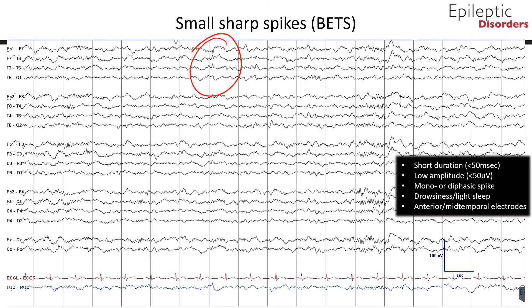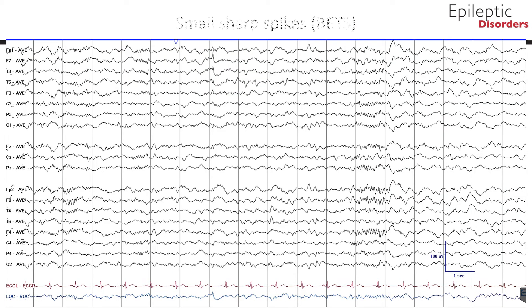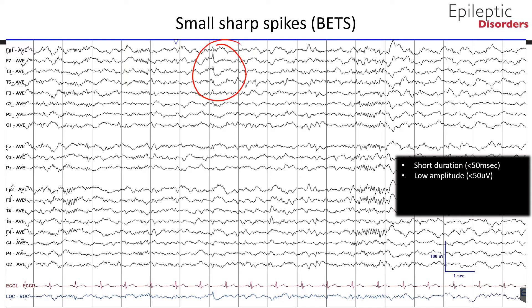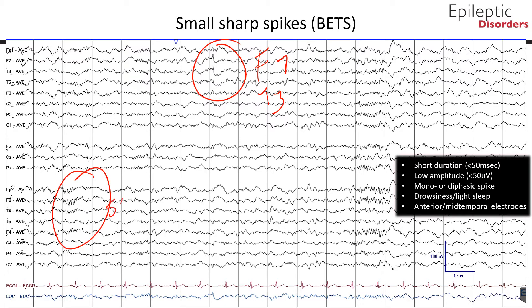They are a very common EEG finding, seen with up to 25% incidence in the normal population. This bipolar montage shows a small sharp spike in the 7th second of the page. The sensitivity of this EEG is at 5 microvolts per millimeter for better visualization of the small sharp spike, which is generally less than 50 microvolts in amplitude. In this epoch, the small sharp spike can be seen in the left frontal F7 and T3 region, outlined in the red circle. This is an average montage of the same patient showing small sharp spikes, best appreciated in the 7th second of the page, with maximal amplitude at F7 and T3, and short duration less than 50 milliseconds. They are maximal in the anterior and mid-temporal electrodes, and are seen in drowsiness and light sleep. This patient is in stage 2 sleep, as noted from the sleep spindles in the second second of the page.